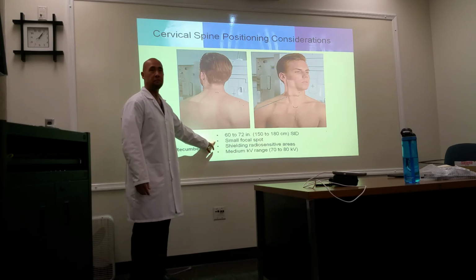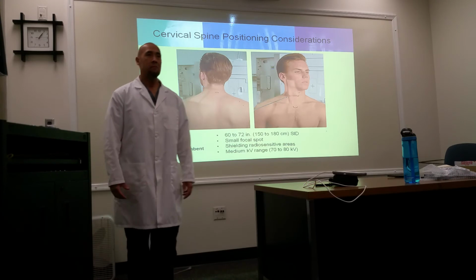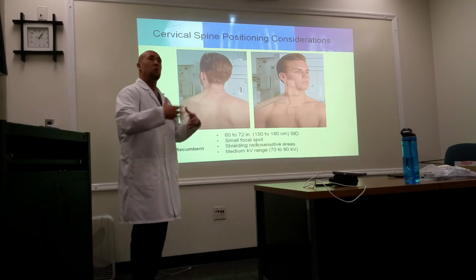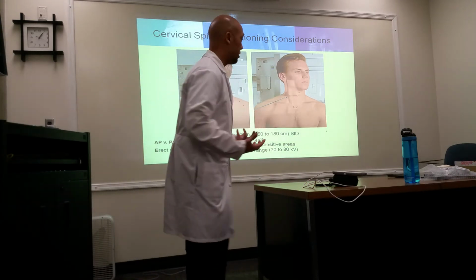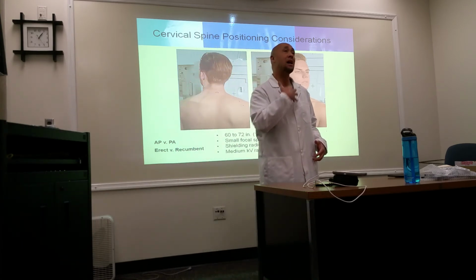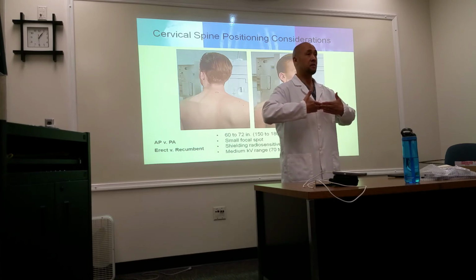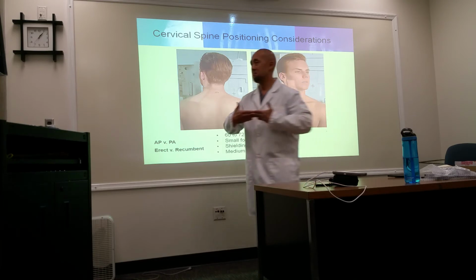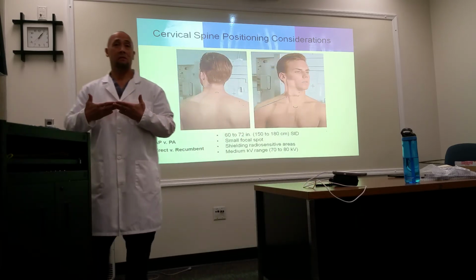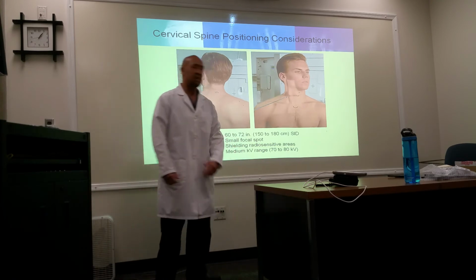Small focal spot for what? Better detail. Shielding. Okay. And again, we're just providing you with the info that you need to know. If we're shooting up here, you're not going to put a thyroid shield up on them, right? But I hope not. What about females? What do we need to protect? The breasts. Okay. You guys have seen C-spines. Do you see anybody protecting the female's breasts? No. Okay. But they should. But you should, okay?